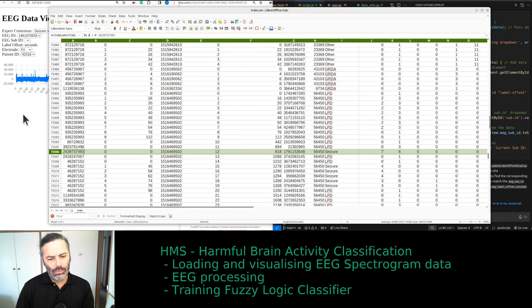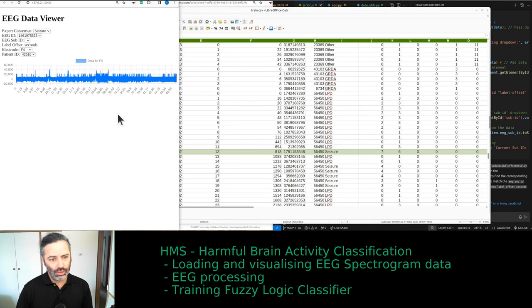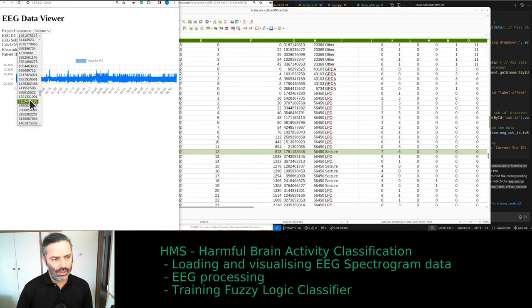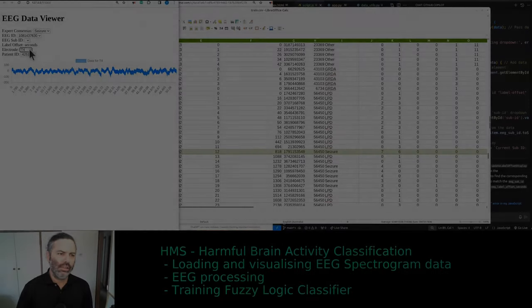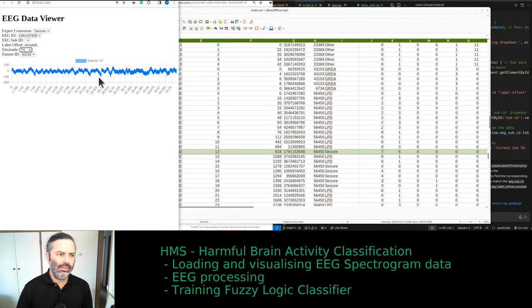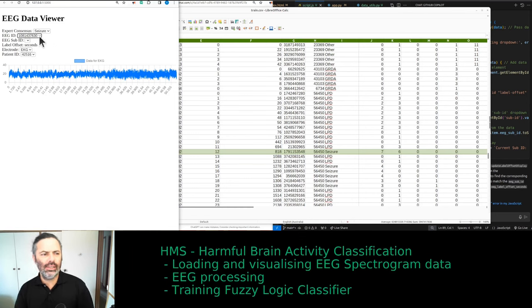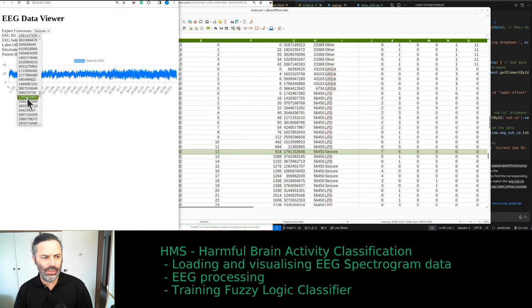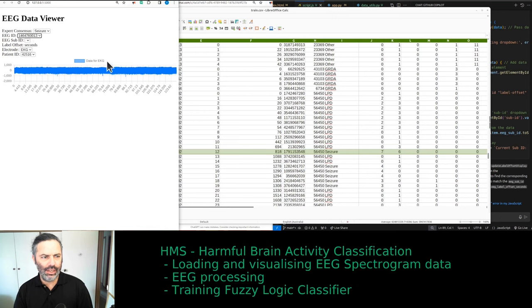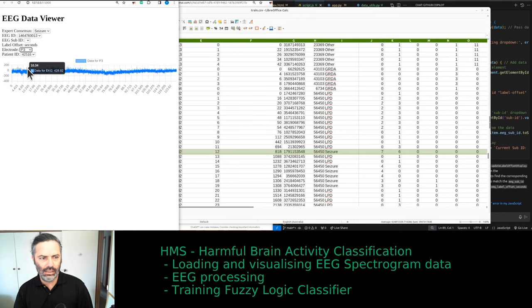We want to display all this in our tool and then do more processing — spectrograms and other things. Eventually we'll be training a fuzzy logic classifier for detection and classification. Some signals show what's probably a motion artifact, and I'd bet the ECG wouldn't be there either. I'd be inclined to discard things like that — there's obviously something very wrong.